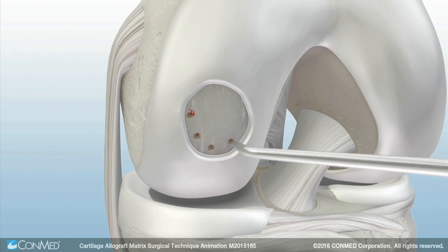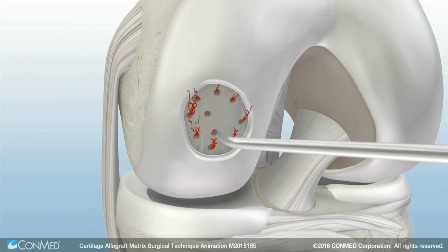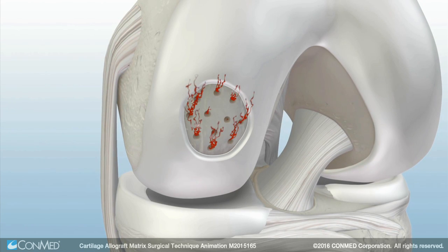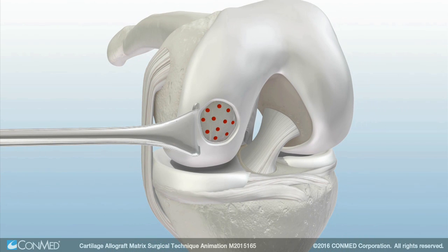Next, perform a microfracture using standard technique. Use a retractor to open the space so the defect dries thoroughly before application of the cartilage allograft matrix.